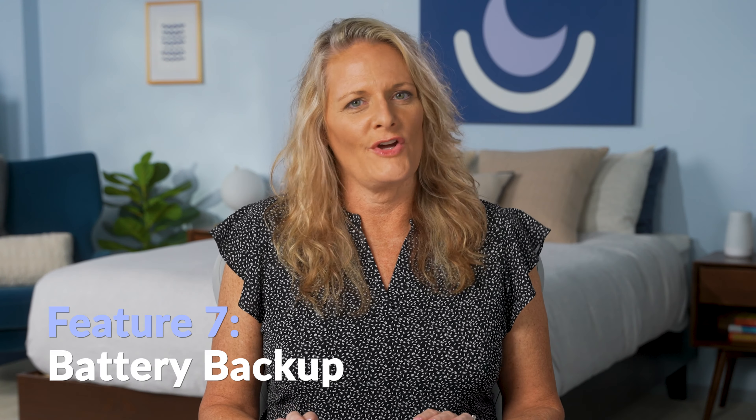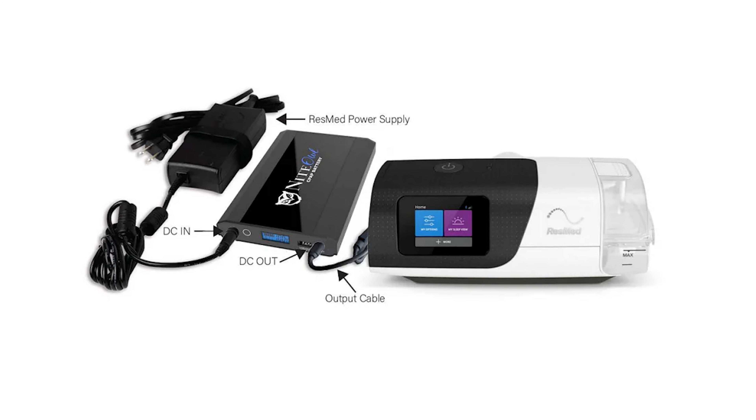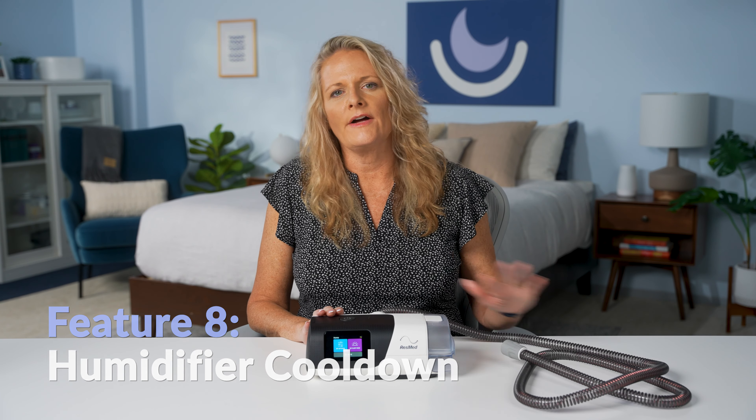Another cool feature is you can access extra settings by holding down the blue and purple buttons for five seconds. By doing this, you can access the advanced settings to show you more details in your sleep view. Please do not change your pressure settings in this menu as those were prescribed by your doctor. In the advanced settings, you can see your events per hour, average pressure, how much your mask is leaking, and you can also see your data from one day to one year when you go back to that sleep view menu.